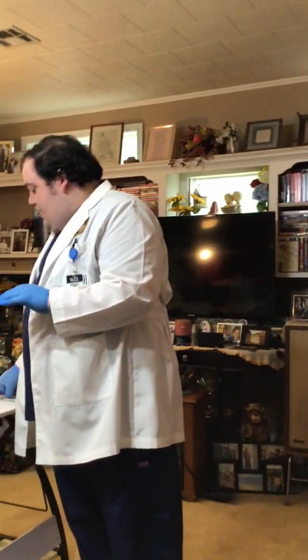All right? I'm going to say, okay, Mr. Doe, I'm going to give you your insulin. It's time for your insulin. You're going to get 25 units of insulin. Okay?